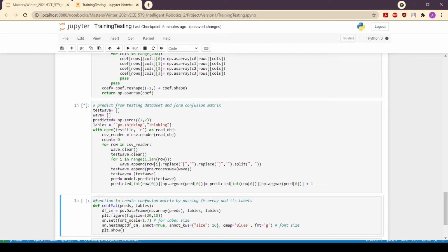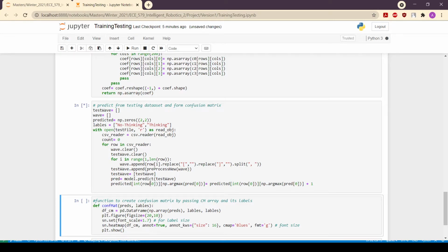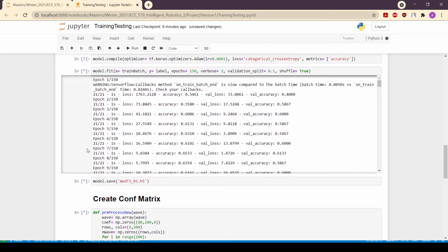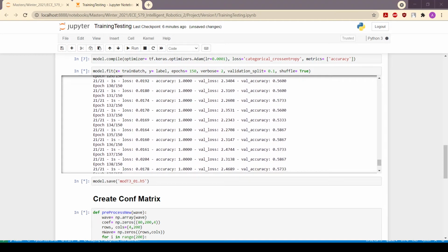This later section again performs the transformation, but here it also tries to predict. We previously created a testing file, so it will take the testing waves, pre-process them, and pass them to the model we created earlier and try to predict correctly whether I was thinking or not. Depending on the predictions, it will create a confusion matrix. So it is still in the process of training. I'll pause for now and I'll start again when the confusion matrix is done.